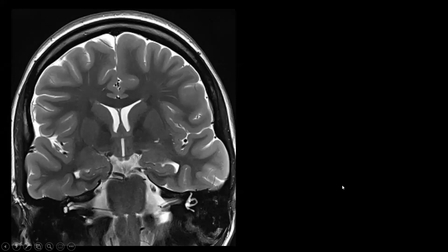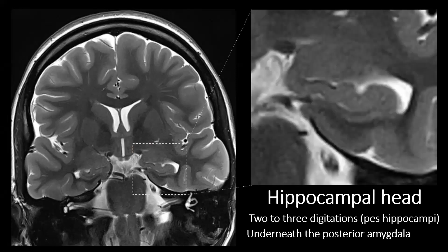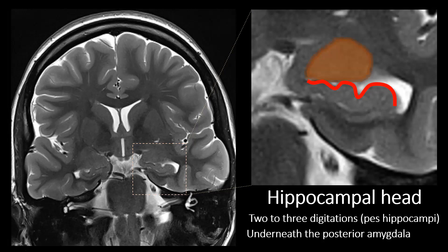In a coronal T2-weighted image centered at the level of the hippocampal head, we can recognize the hippocampal head by two or three small digitations called the pes hippocampi or hippocampal feet. On top of the hippocampal head, we see part of the uncus and a lot of gray matter — this is the posterior part of the amygdala. The amygdala is also part of the limbic system and plays an important role in emotion regulation and processing, especially fear.